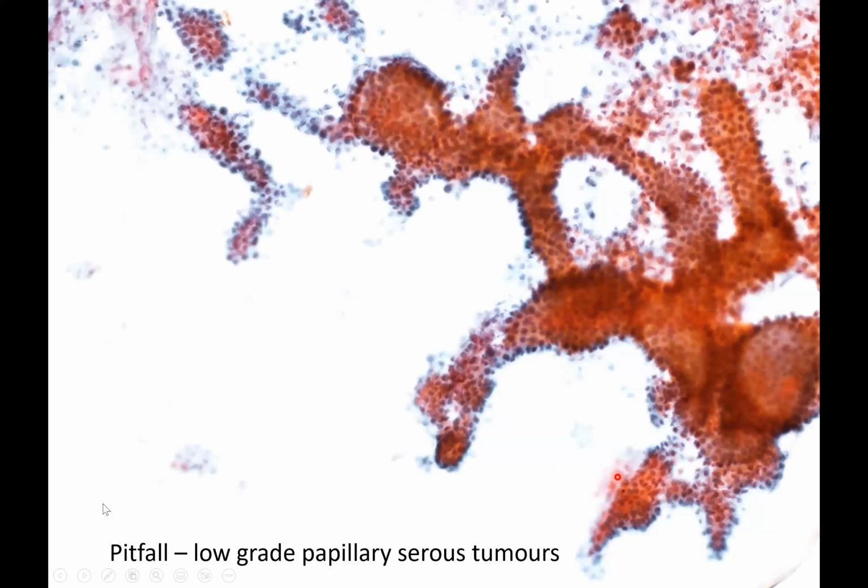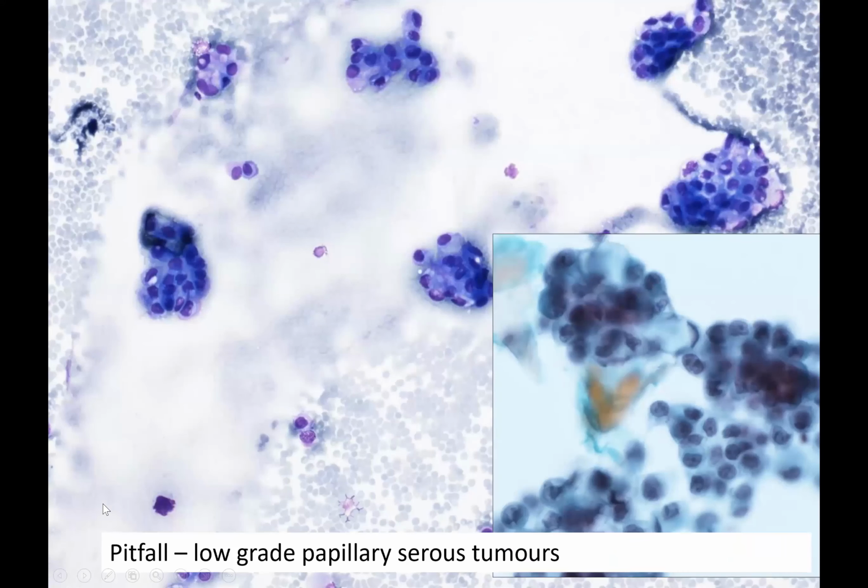Here are washings from another case. It's highly cellular, as you can see, with numerous papillary fragments and balls. As there is actually some nuclear atypia, I was initially tempted to call this low-grade adenocarcinoma, but as low-grade serous lesions do need to be correlated with this histology, the international system would recommend calling this AUS, at least in the interim.